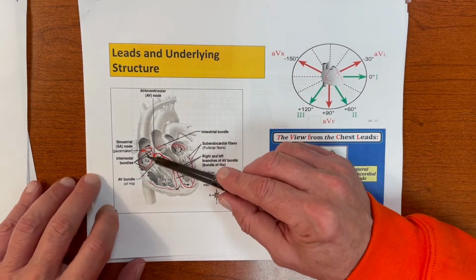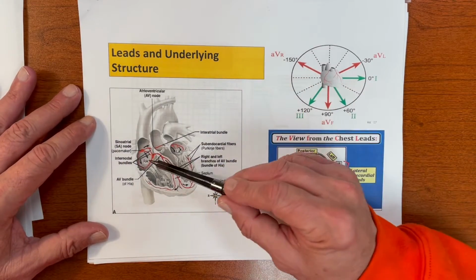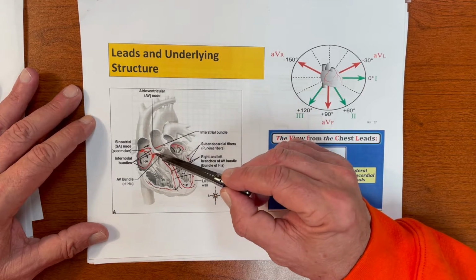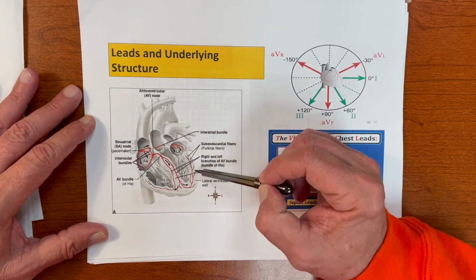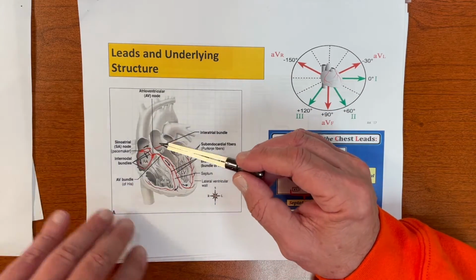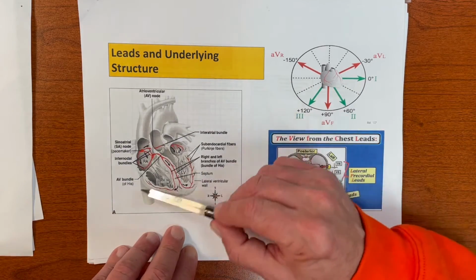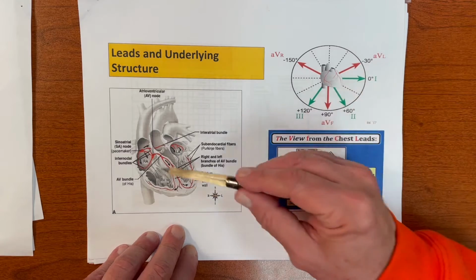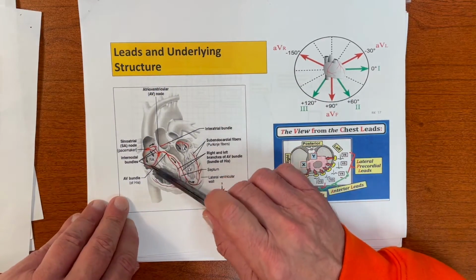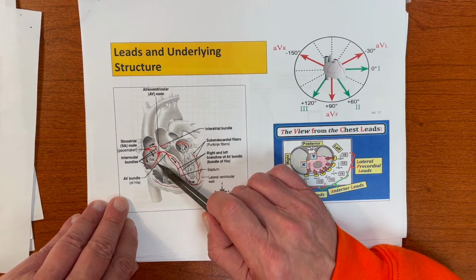You have to understand, I always think of the heart at this angle. Here's the conduction system. There are the great vessels, the sinus node, the AV node, then the bundle branches. So that's the underlying structure. I'd like to point out something interesting, though. This becomes important: the orientation, not only to leads, but also to itself. Notice that the atrium actually tilts under the AV node to a large degree here.